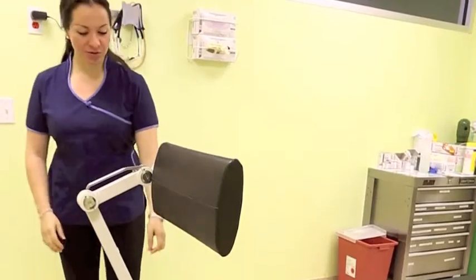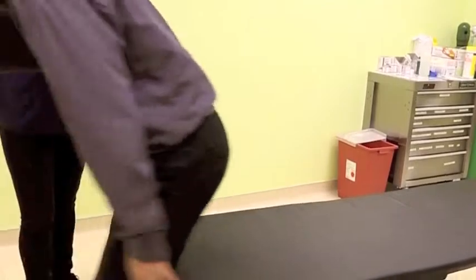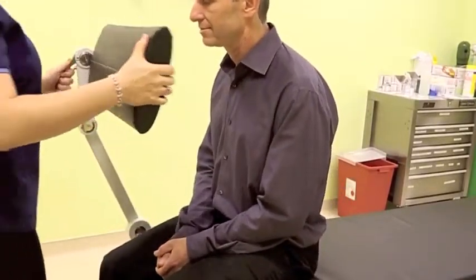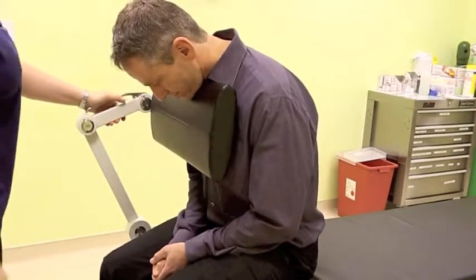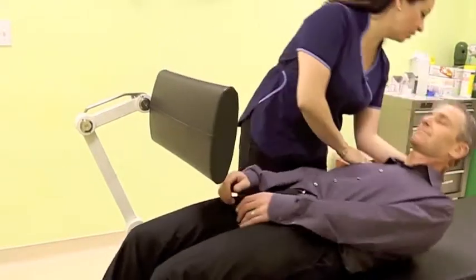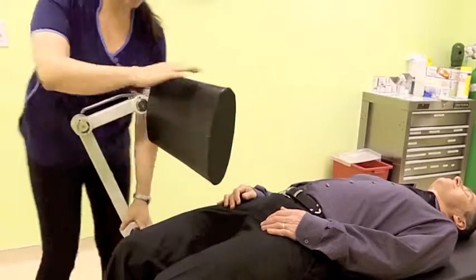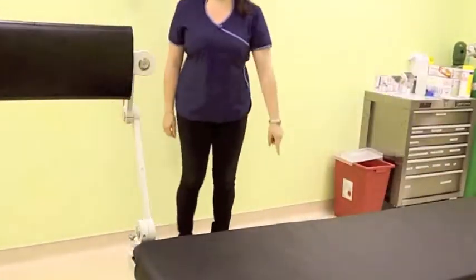And this is how we position the patient. The patient sits at the edge of the table. We adjust it, and the patient leans forward. Also, if the patient is not feeling well, you put him down. You can also adjust it at this edge of the table.